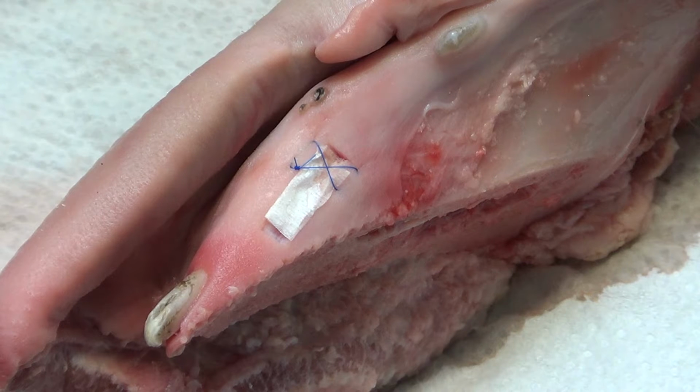Okay, are you ready for the vestibuloplastic flap?